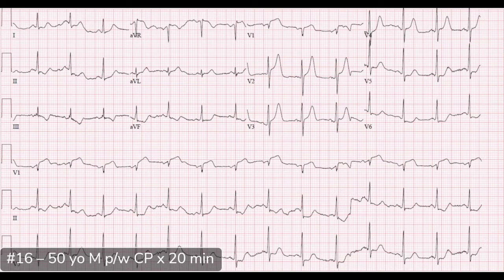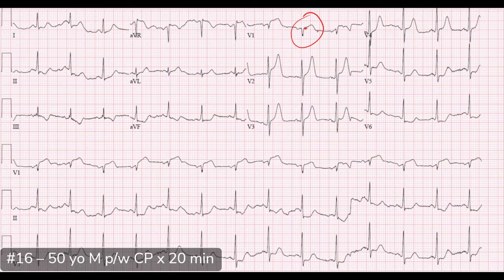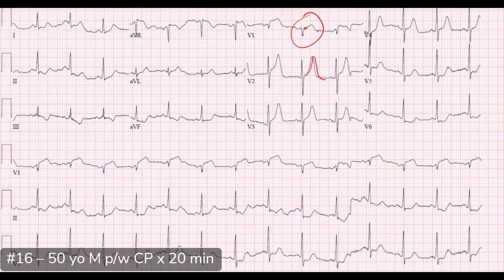Starting at V1, there's about one millimeter of ST elevation. As we continue through the precordium into V2 and V3, while I don't think there's a ton of ST elevation, those T waves look hyperacute to me. The size of the T wave in comparison to the QRS complex looks large, which is concerning for hyperacute T waves.